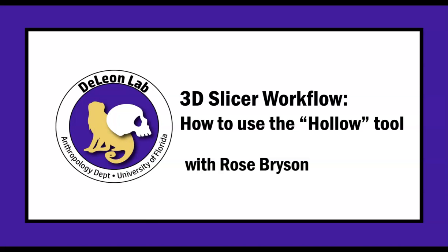Hello, my name is Rose and in today's tutorial we're going to talk about how to use the hollow tool in 3D slicer.